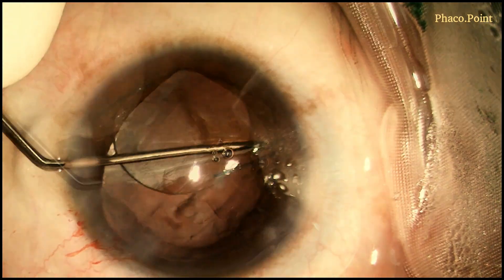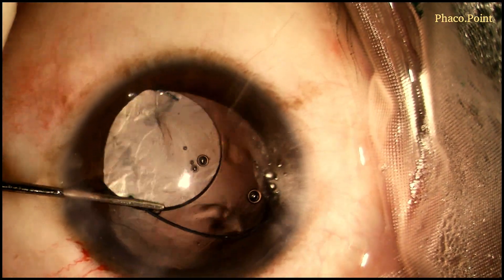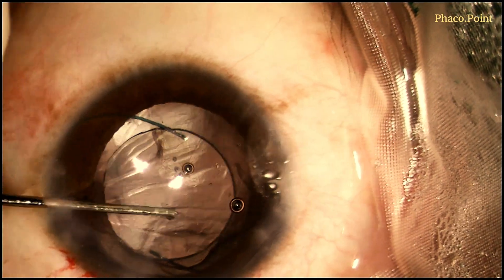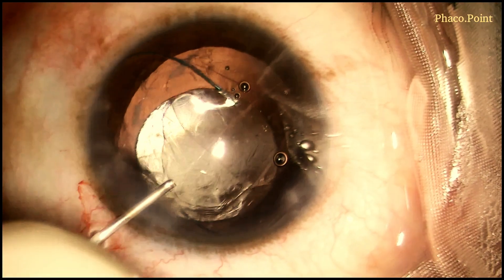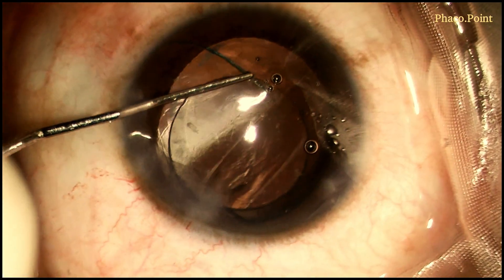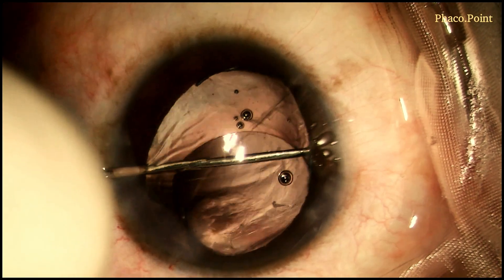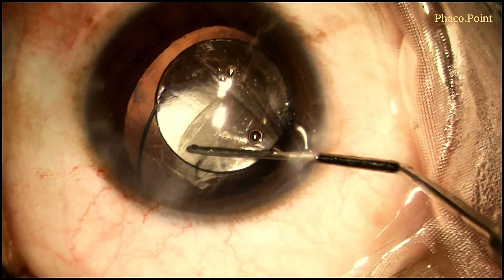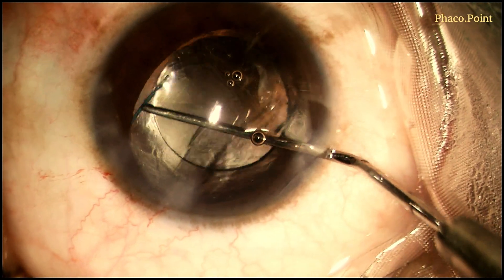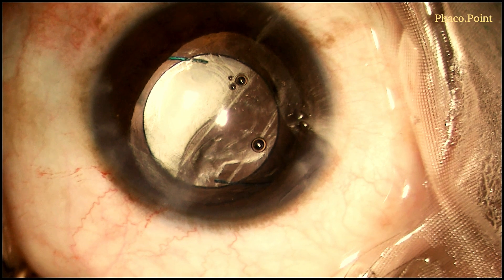While rotating the IOL in the ciliary sulcus, the leading haptic accidentally slips out of the sulcus into the anterior chamber — the entire lens is now in the anterior chamber. Once more, viscoelastic is placed into the anterior chamber to deepen it and with the help of a Couglin hook hitched at the trailing optic-haptic junction, first the trailing haptic and then the leading haptic is once more rotated into the ciliary sulcus. It is rotated further to achieve an orientation of the IOL such that the haptics are at right angles to the tear.